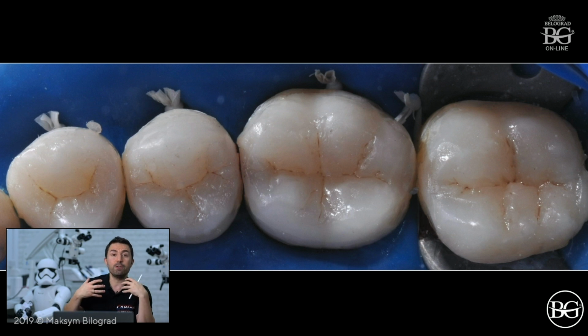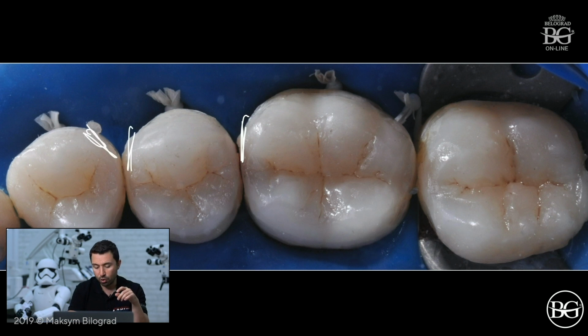So nowadays, if you reline with a transparent silicone, you do copy-paste and everything will be done from A to Z immediately. You'll save a lot of time, and there are some tips and tricks on how you can avoid overhangs in between teeth in order to save your time for finishing and polishing. This picture was taken before I did my final finishing and polishing. That's why we have overhangs here.